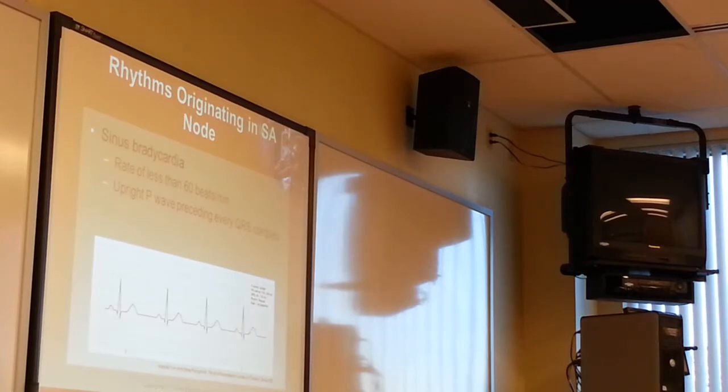Okay, sinus bradycardia. Anything below a heart rate of 60. Upright P preceding every QRS complex. Is that a bad thing? Not necessarily. Runners, people that work out could have sinus bradycardia.